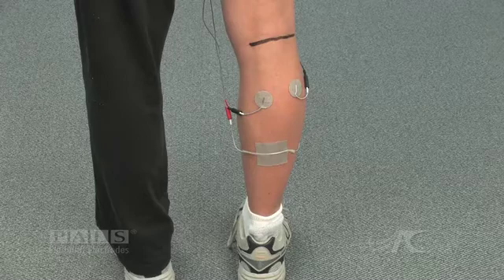The positive lead from both channels is placed into the dual lead wire electrode positioned at the distal most component of the gastroc muscle.